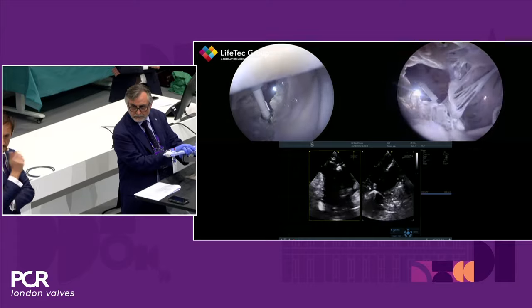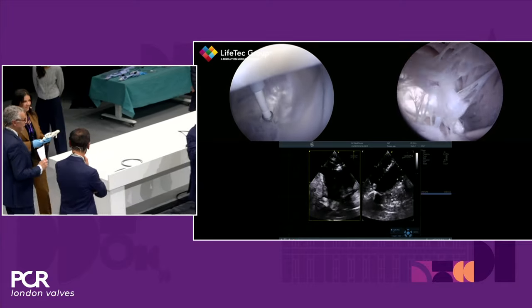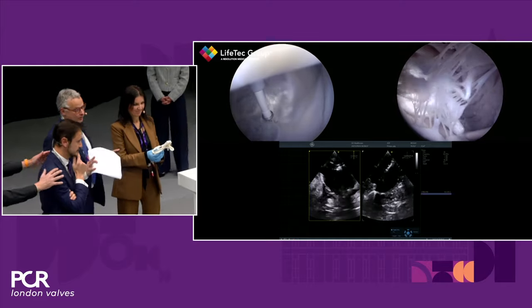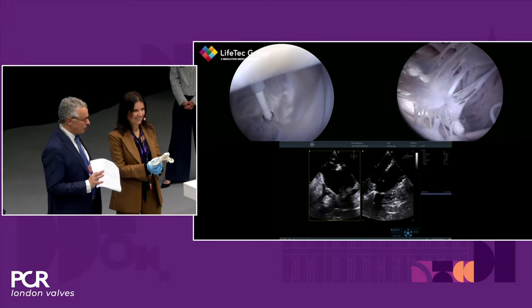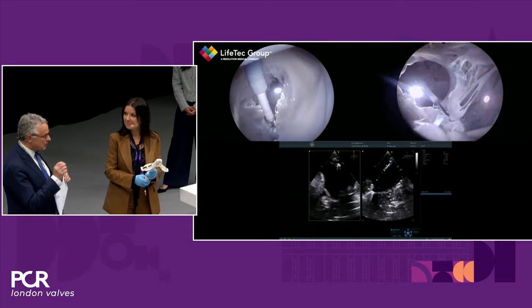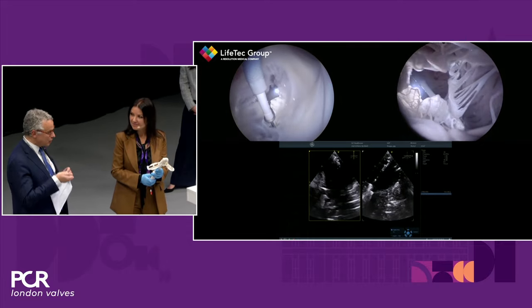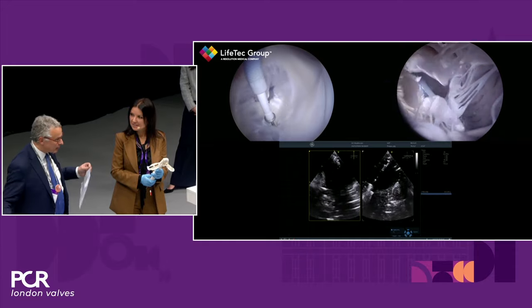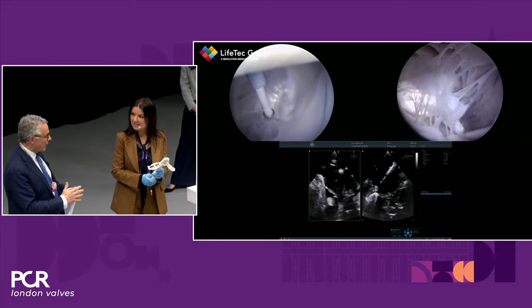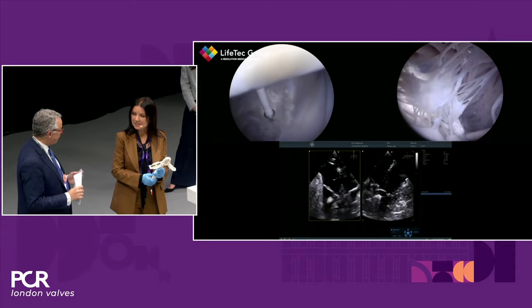So now the point is, let me ask Anya to help us. Anya is our expert on device. So she will tell us one important thing. I have a question for you. The tricuspid is really tiny, very soft tissue. How dangerous is it if I reopen the clip arms and I grasp twice, three times, maybe I don't see well? What is the effect on leaflets?